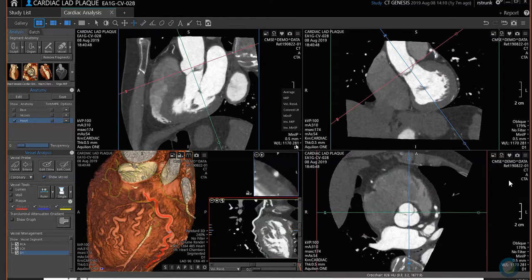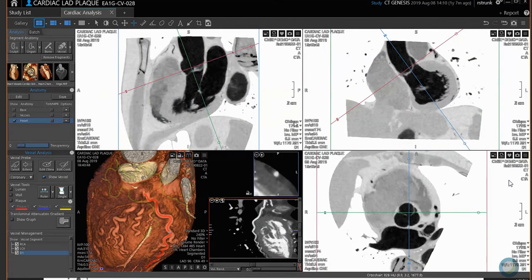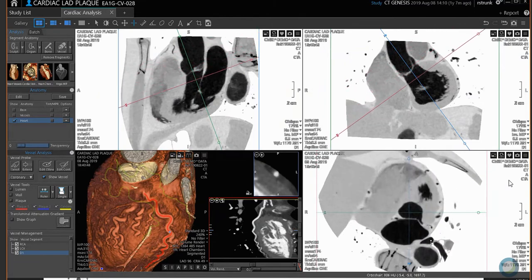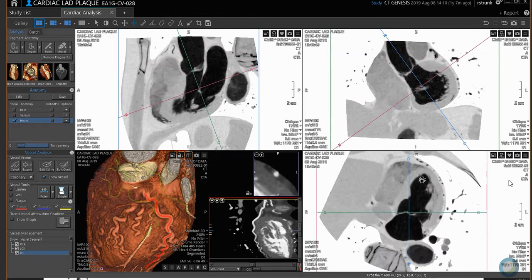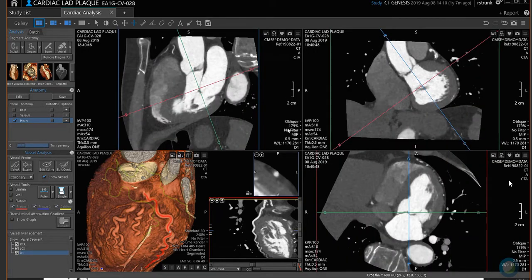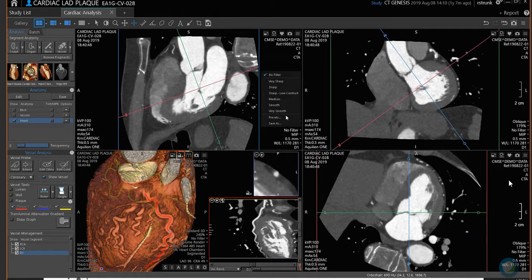The other rendering options available are called Inverted — so like an Inverted MIP: instead of making the dense structures bright, it makes them black. And there's also the Inverted MinIP. Those are just the inverted versions of those options. There's also a Filter option — it's a denoising filter. If you can't change the kernels and you have this option, there is a way to change from sharp to help look inside stents a little bit better, but not all sites have it.